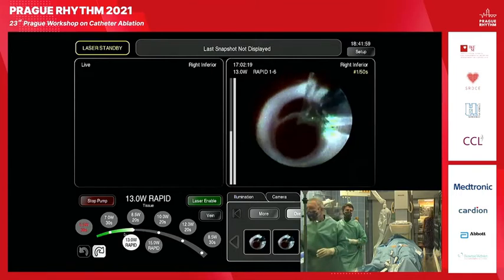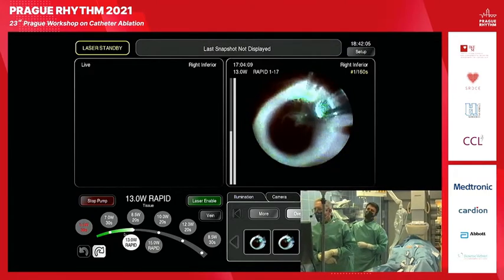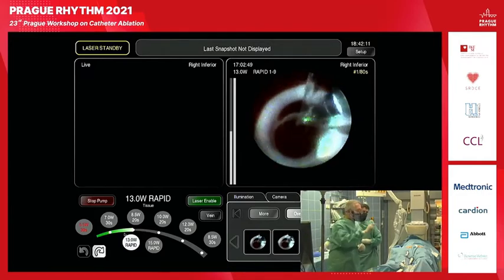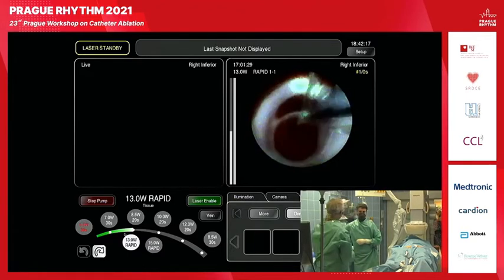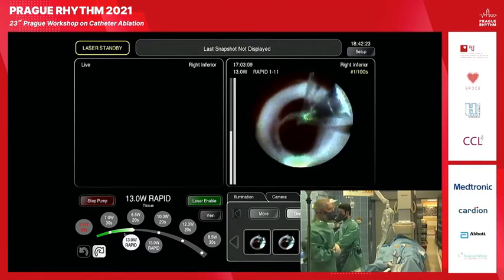And this vein was done in 177 seconds. And all three veins we did by single rotation without any manipulation of the catheter. So the only vein we didn't treat is the right superior one.